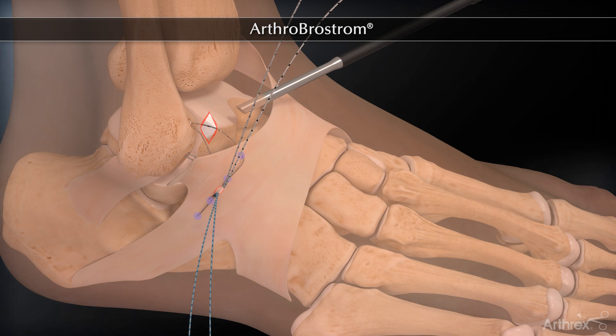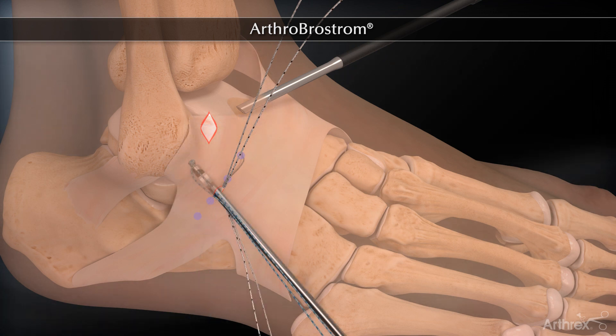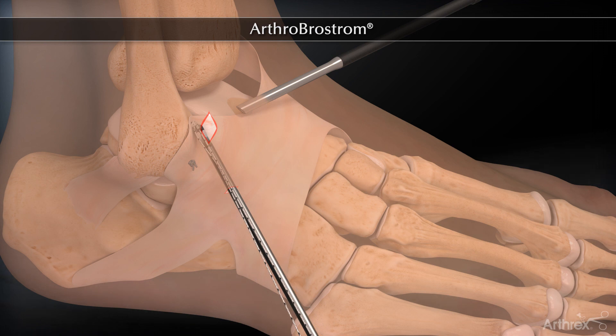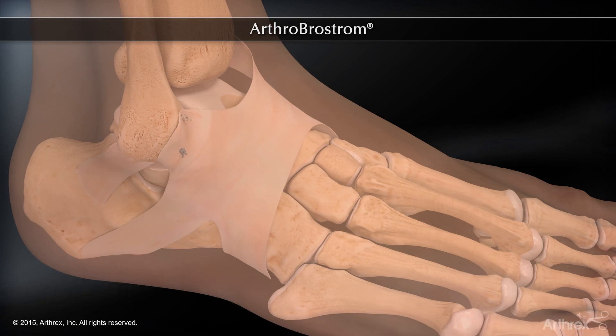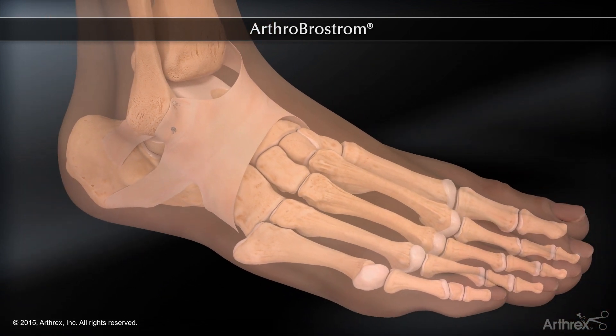With the ankle held in the appropriate position, the suture limbs are tied tightly down. The Arthrobrostrum avoids the need for ancillary portals and traditional open incisions while decreasing operative time and recovery time.